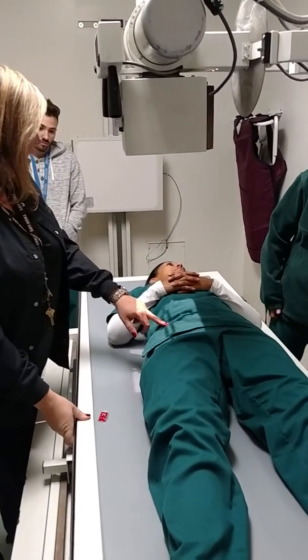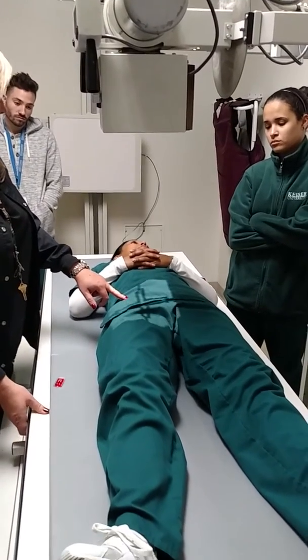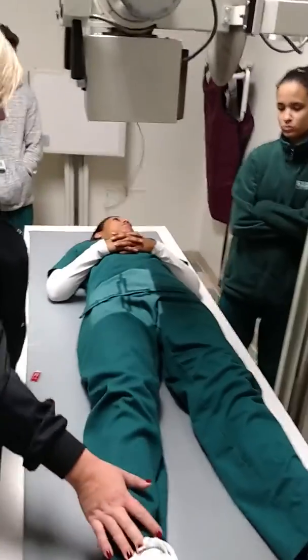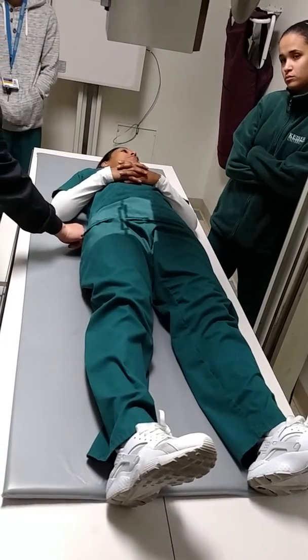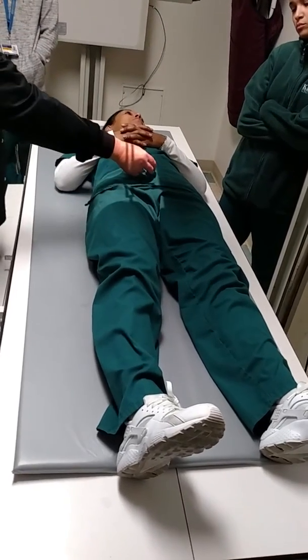So I'm going to start at ASIS. I'm going to go 1 to 2 inches medial, 3 to 4 inches inferior. That's my central ray. But it's an AP hip, so this leg has to come in 15 to 20 degrees. I got room up there. If I didn't have room, now I'm doing a hip, so I don't want to put the marker in the hip, I can put it up here.